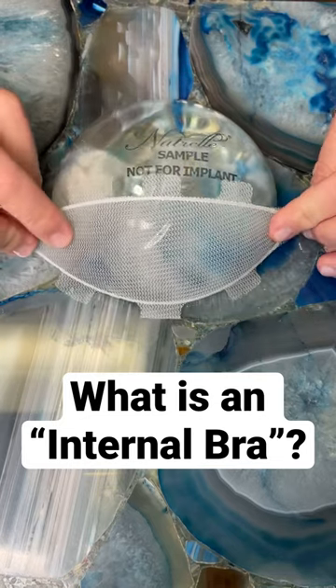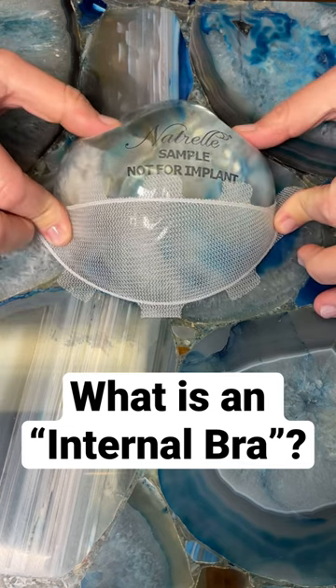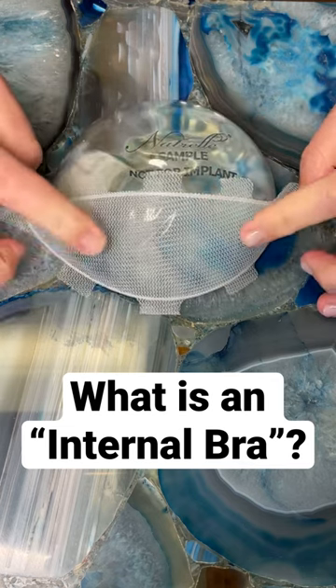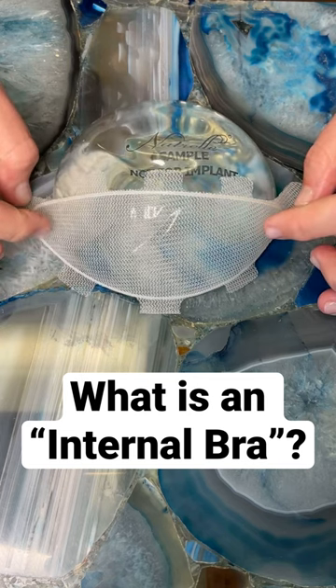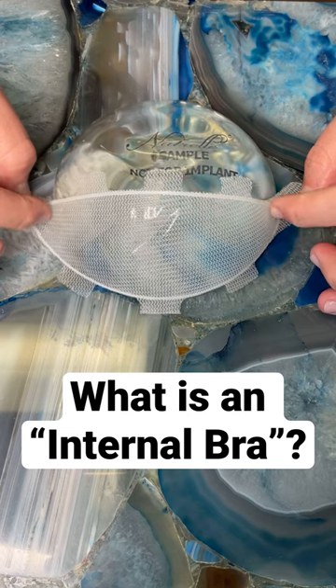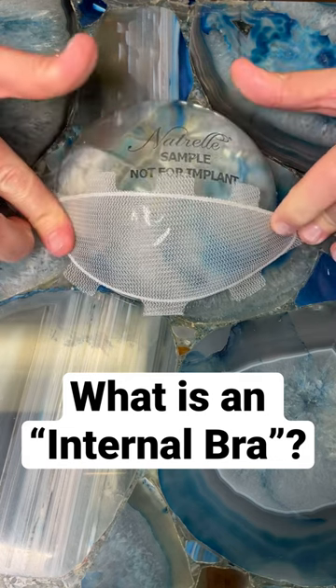When we inset it, we inset it along the lower pole of the breast to the chest wall, and the implant is cradled by this internal bra. Over about 18 months, the internal bra incorporates into the tissue, releasing growth factors that produce collagen to strengthen the tissue and prevent the forces of gravity.